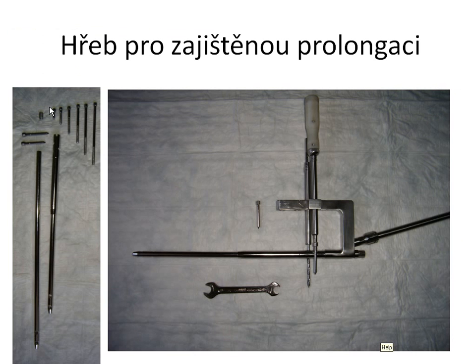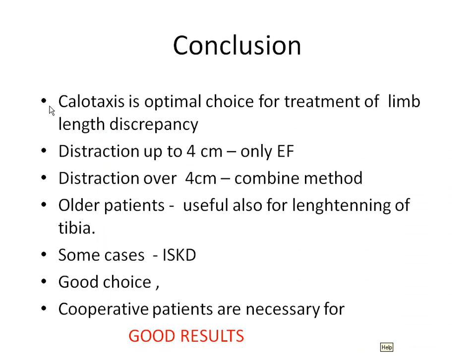We developed, with people from Czech factories, a nail for this locking nail lengthening, which we can lock from this side. We don't need X-ray to lock it distally, so it's quite simple.